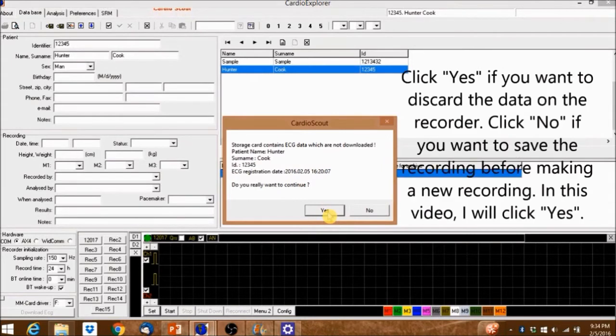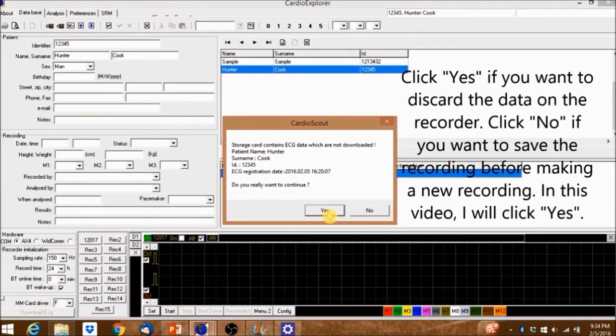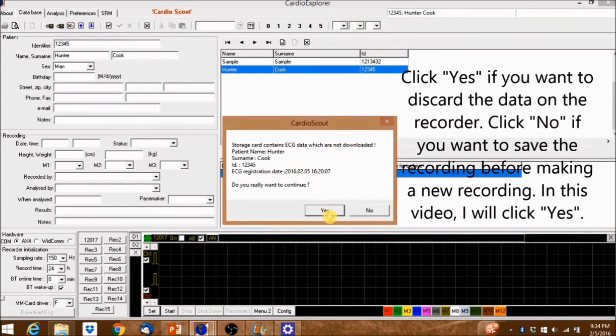Click Yes if you want to discard the data on the recorder. Click No if you want to save the recording before making a new recording. In this video, I will click Yes.